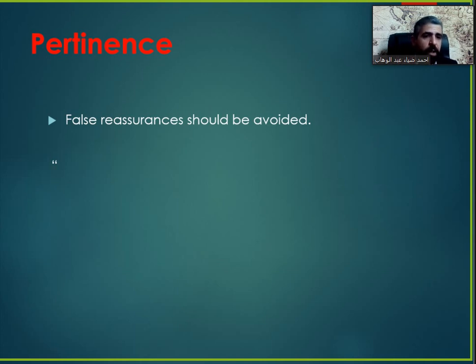Don't reassure. For example, "spinal metastasis without evidence of epidural extension" on a CT report disregards the fact that the routine CT is not accurate in this assessment and may give a false impression to the clinician. When you see spinal metastasis and you write no evidence of epidural extension, this is wrong. You don't evaluate epidural extension based on the CT scan. You need MRI. So don't write that, okay?